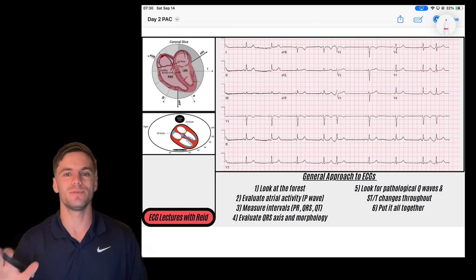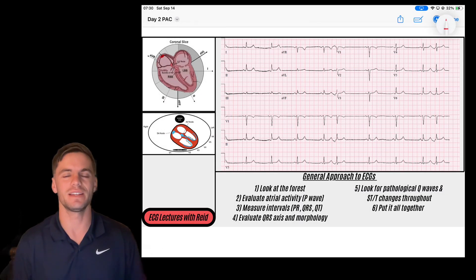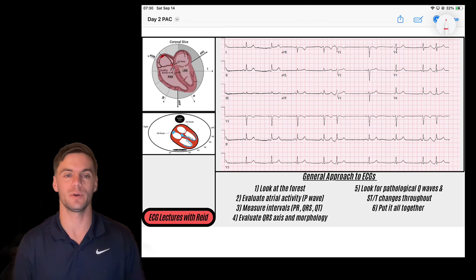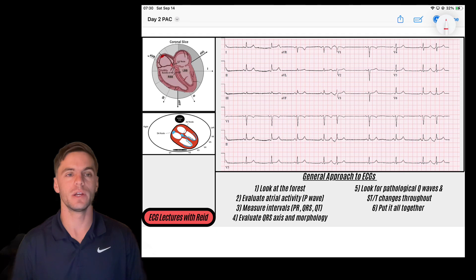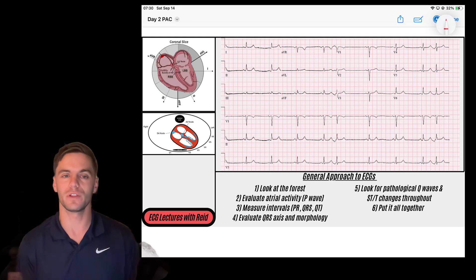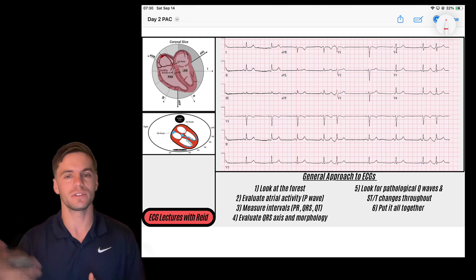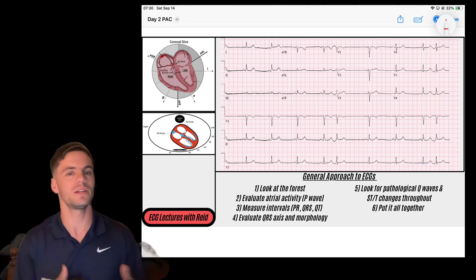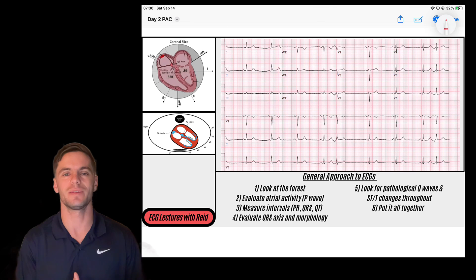Hey everybody, welcome back to day two of our 30-day EKG challenge. Today we have a fun EKG and a really fun concept to go over — the premature atrial contraction. Remember that you can follow along every single day and we're going to build on every concept, so if you haven't watched day one, check it out in the playlist.